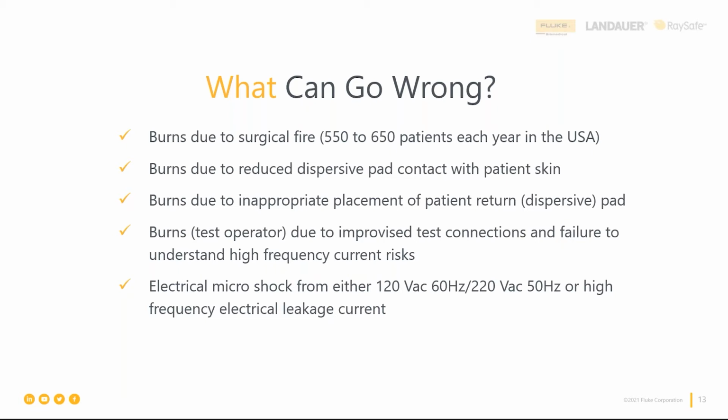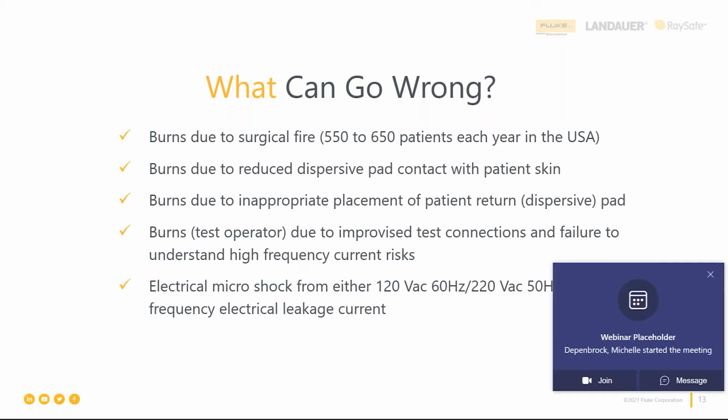I've seen a bunch of those go wrong too. After 20 years of being in the ORs, a lot of these issues can be on an anesthesia machine cart or on an endo cart, or they're on their own cart and they're getting wheeled around a lot. So I found a lot of power cords on my ESUs over the time were always cut because they got ran over by another cart.